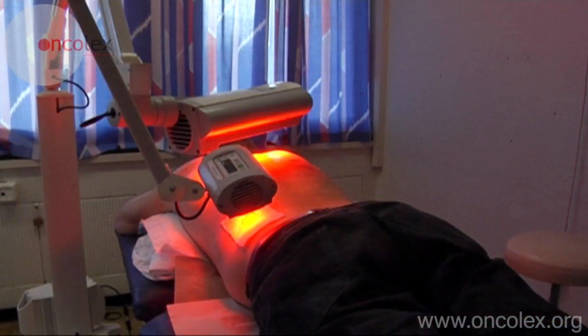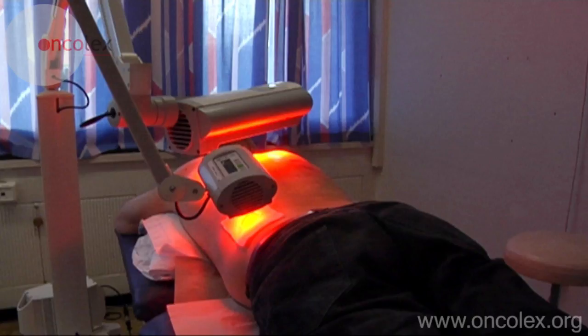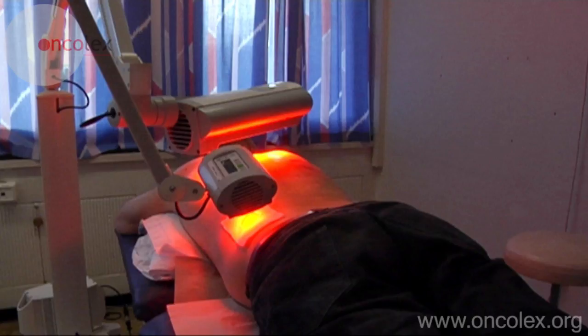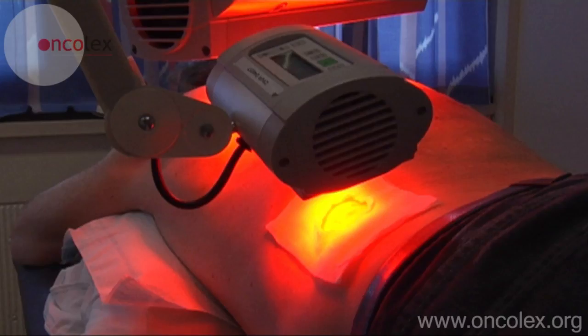By exposing the cells to light, singlet oxygen is formed. This causes damage to the mitochondria and cell membrane, leading to cell death.